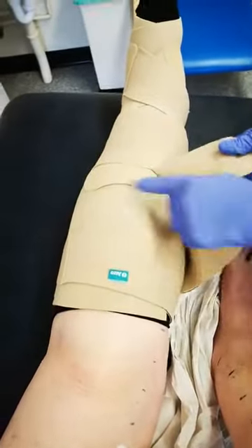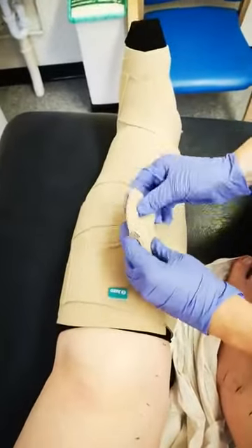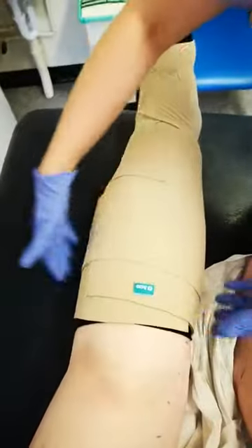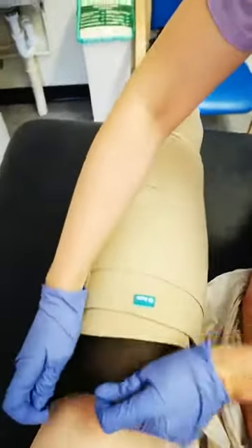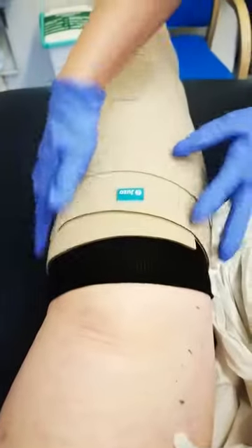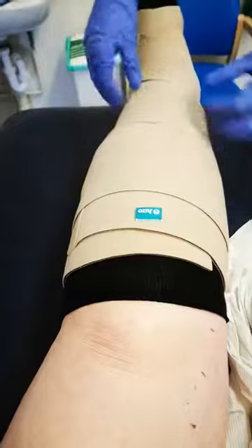This attaches here. She should be able to do it — she will be fine. So we're up to the knee, that's it. If it gets a bit marked you can release it. How does it feel? It feels tight — just unusual. Do you want me to release it? No, I want to keep it.